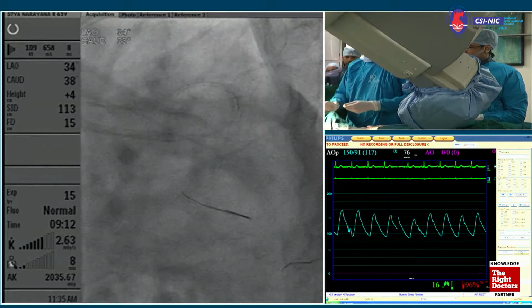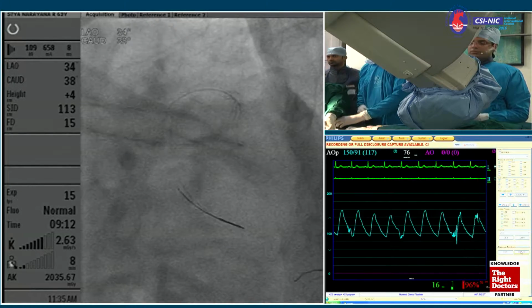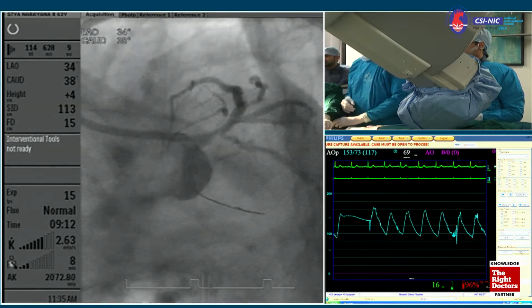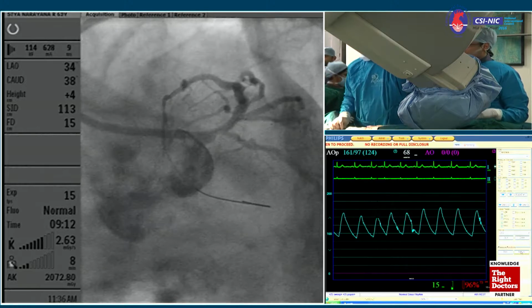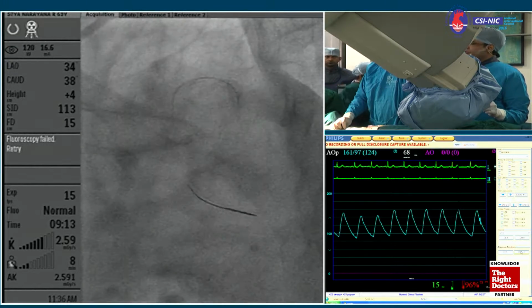Actually, I will go for a provisional strategy from the left main to the LCX. Then I look at the LAD ostium by IVUS and FFR, and if it is significantly involved, then I will finish with the TAP technique. In addition, I think Dr. Clare's point is quite valid. Can you have a little more discussion on this?